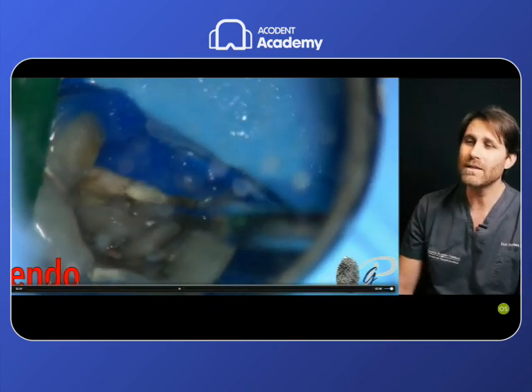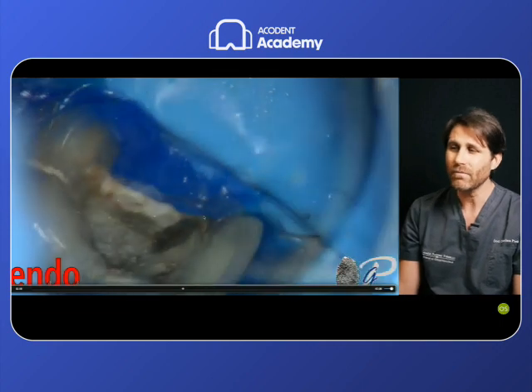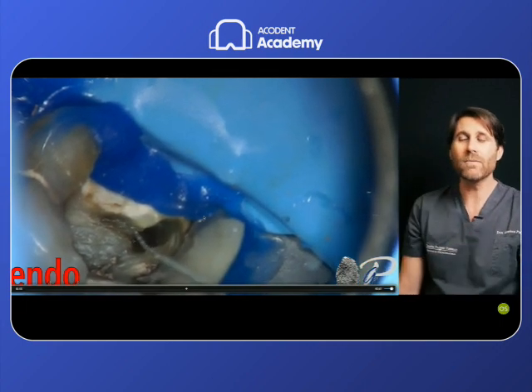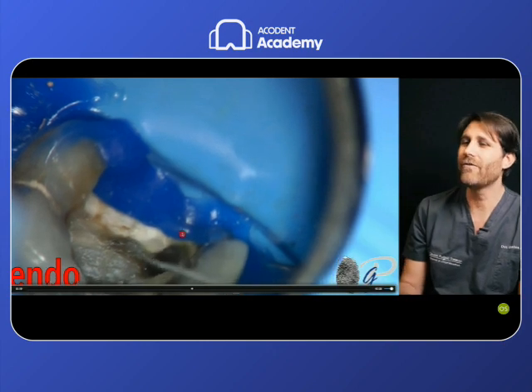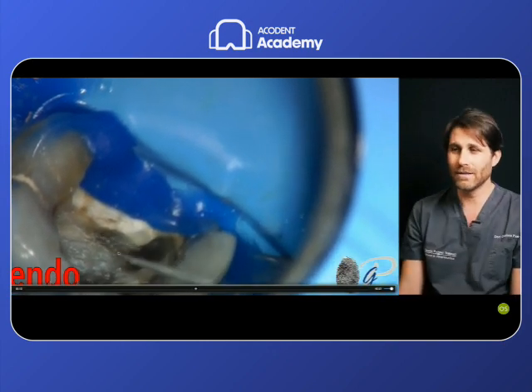Going deeper inside the root, we remove more calcification, we make the trajectory easier for the file, we create more space, and then finally we can try with the mechanical files, because again, hand files here, like you see here, don't penetrate anything in this orifice.